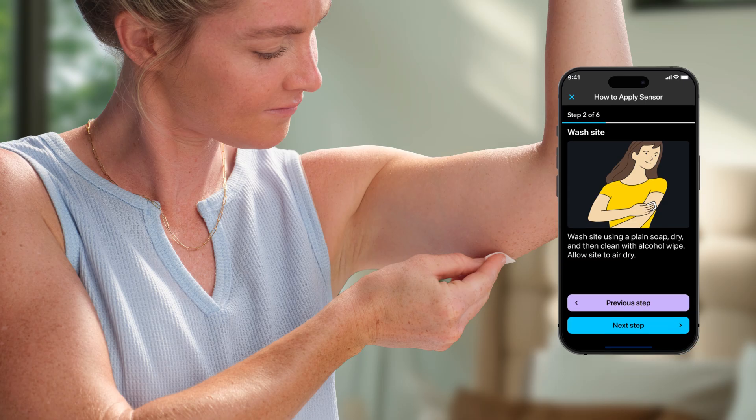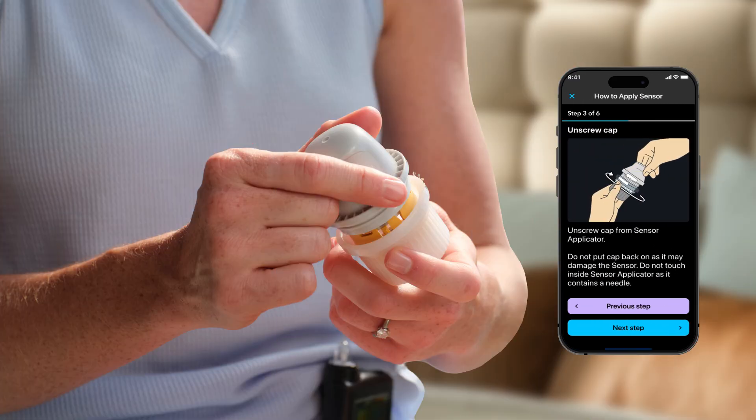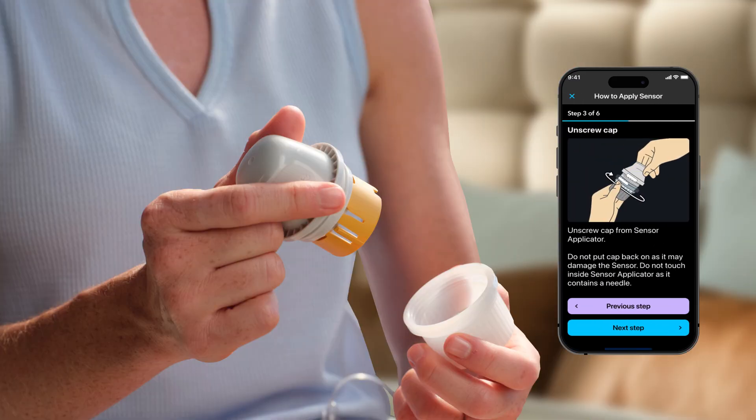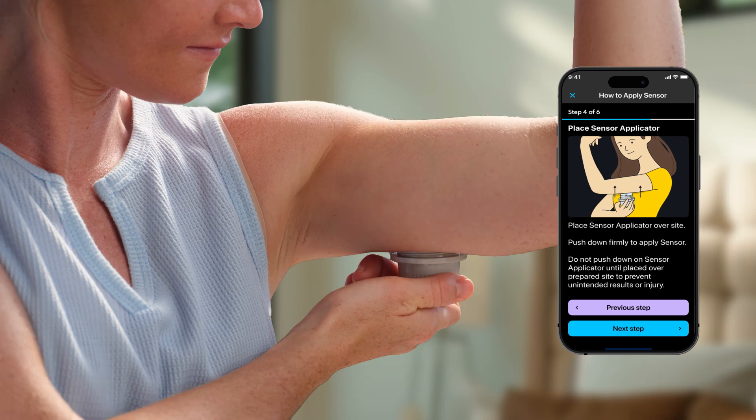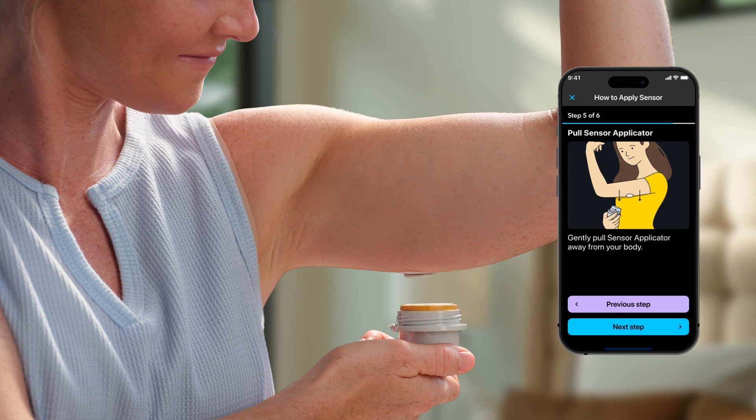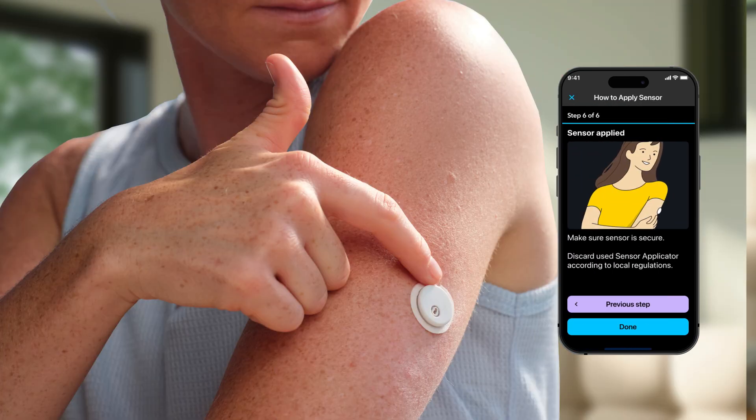Prepare your site by washing with plain soap. Let it dry. Then clean the site with an alcohol wipe and allow to air dry. Next, unscrew the cap from the sensor applicator. Place the applicator over the site, then push down firmly to apply the sensor. Gently pull the applicator away and make sure the sensor is secure.